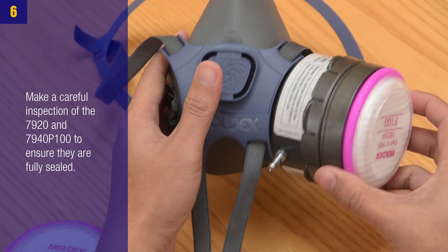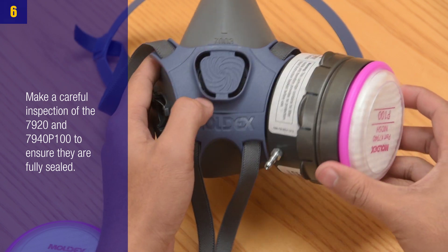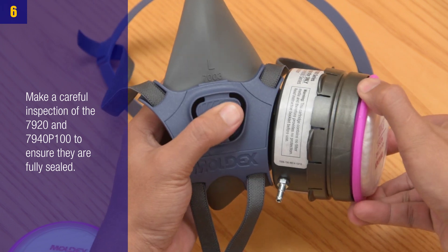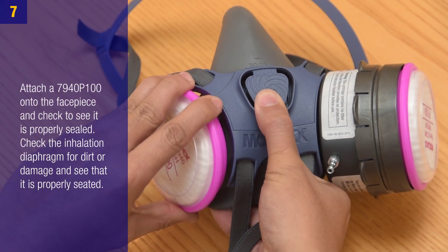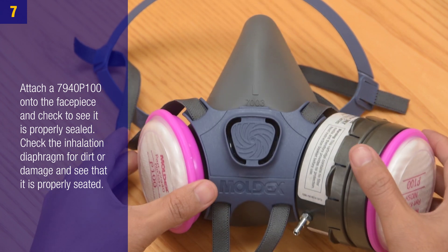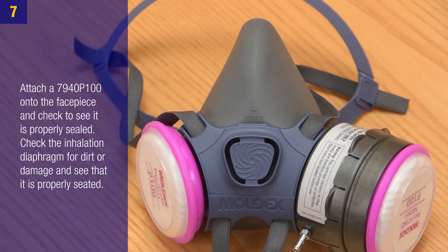Step 6: Make a careful inspection of the 7920 and the 7940 P100 to ensure they are fully sealed. Step 7: Attach the 7940 P100 onto the face piece and check to see if it's properly sealed. Check the inhalation diaphragm for dirt or damage and see that it is properly seated.